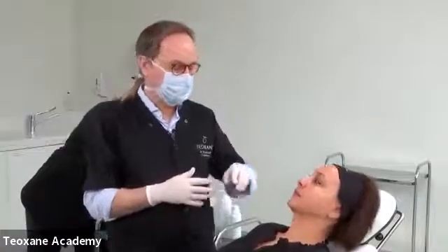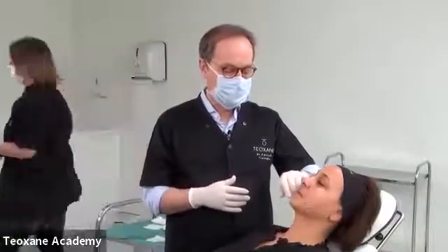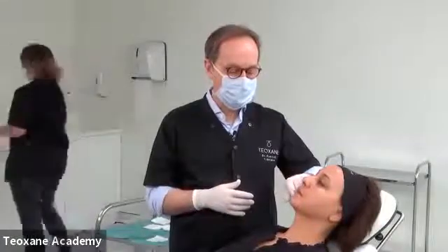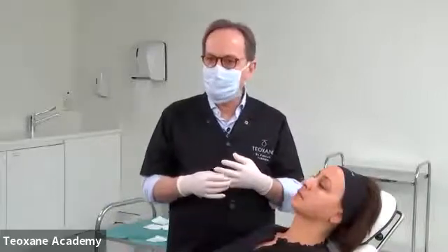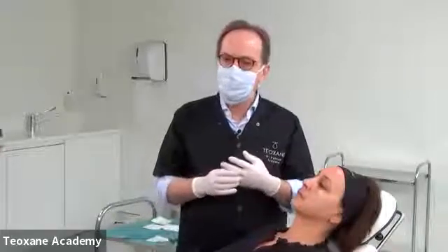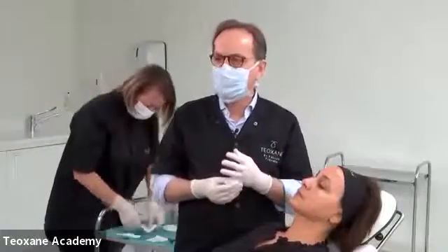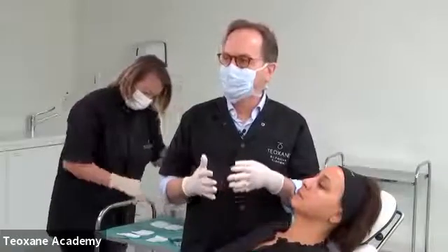Maybe, Dr. Trevidic, we've got a question just before. It was during your presentation. Can using a small gauge needle affect the properties of hyaluronic acid gel? You have with Redensity 2 a 30 gauge needle in the blister. And normally the recommendation of the company is to inject with the needle you have in the blister.